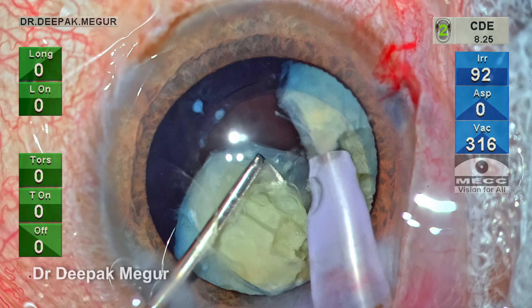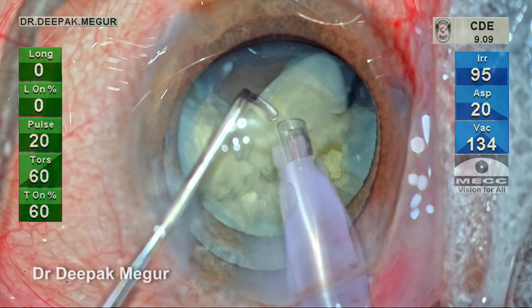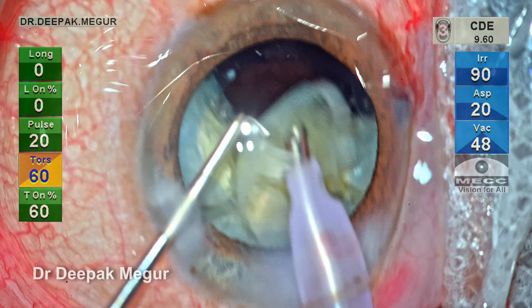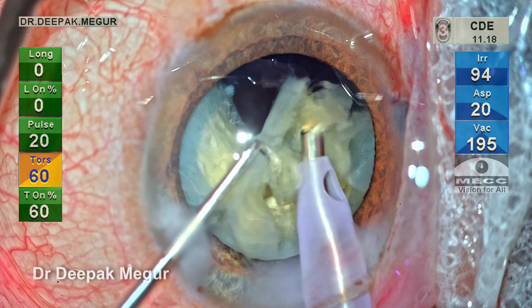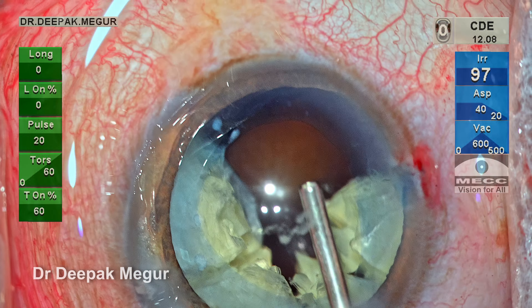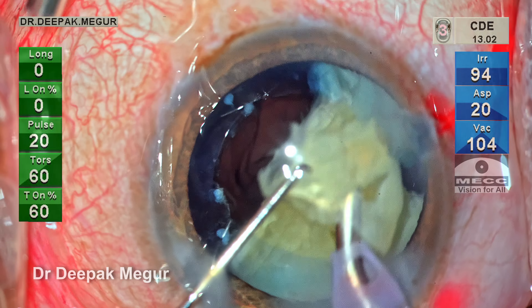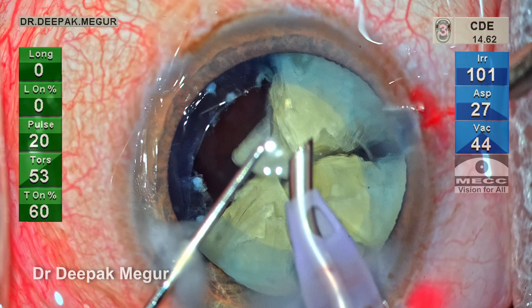The biggest challenge was dividing the nucleus into smaller fragments, and that is done. Now comes the easier aspect of the surgery — quadrant removal. I prefer torsional ultrasound mode, and each fragment is pulled out of the bag and emulsified at the level of the rhexis margin in a controlled manner. We don't want any chatter, we don't want any turbulence. This is controlled by giving the adequate amount of energy.